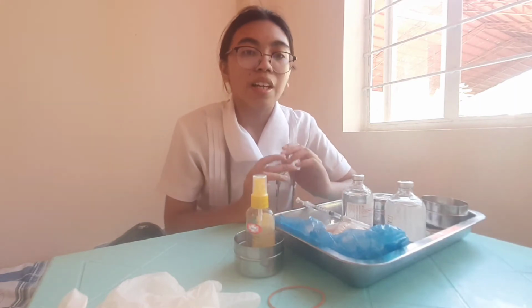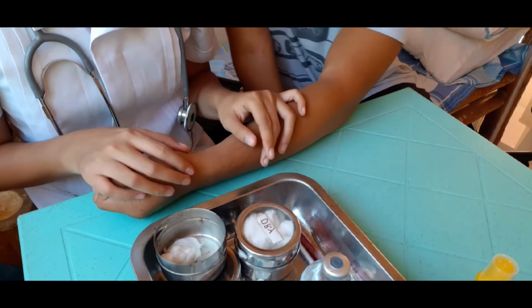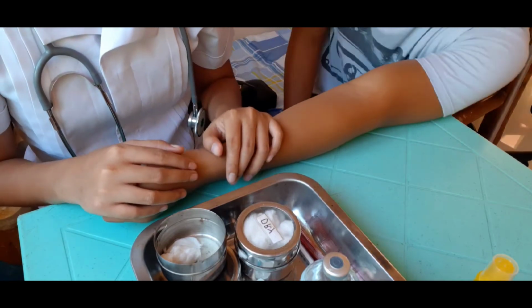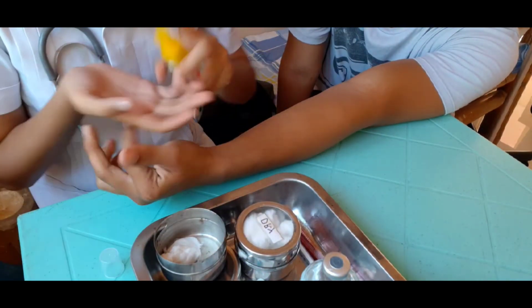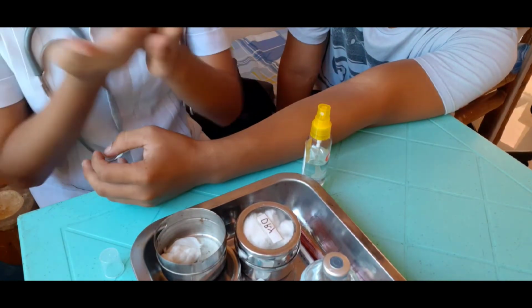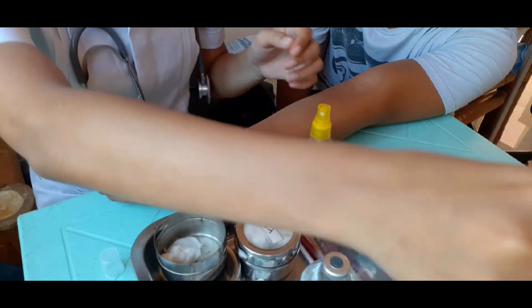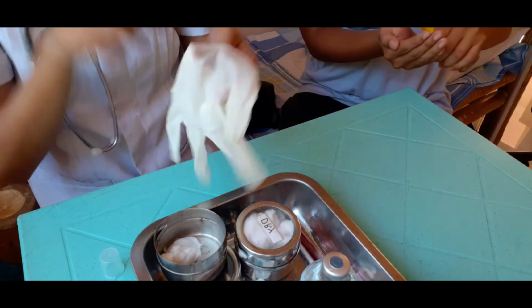So now, we are going to implement the preparation for our patients, administering intradermal injection. So right now, we are going to perform the administering of intradermal injection or the skin test for our patients. So first, we are going to perform hand hygiene for our patient. So first is hand hygiene lang sa ito. Okay. And then also we are now going to use clean gloves. And sir, mag-hand hygiene lang dito sir, while I'm going to use clean gloves.